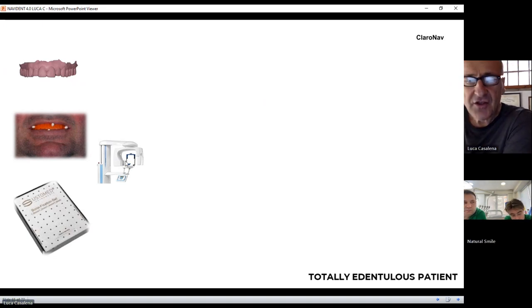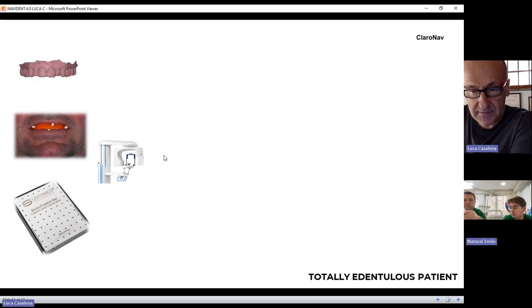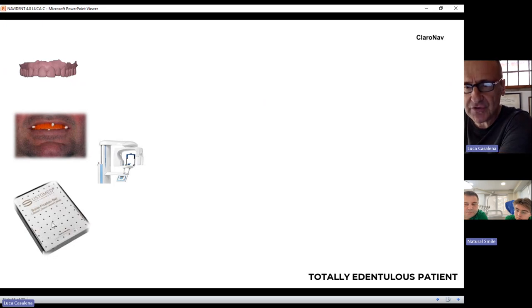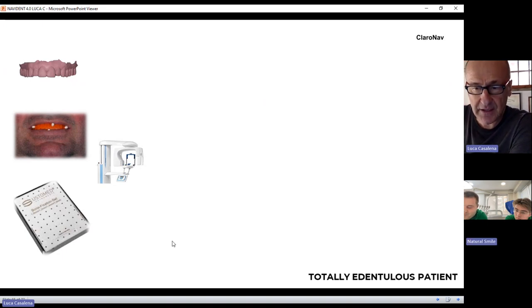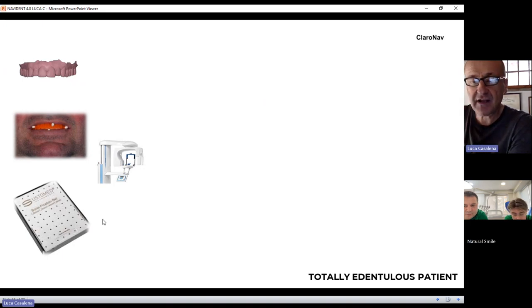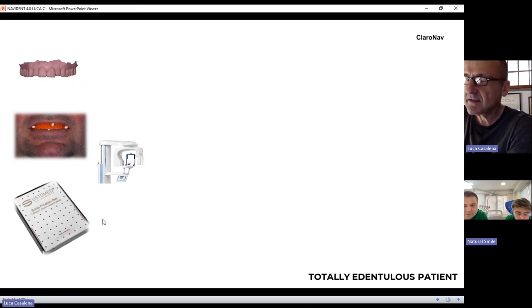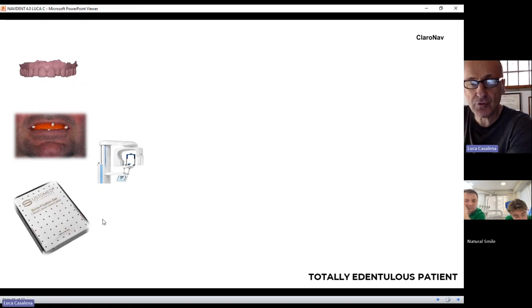Once scanned, you can send the patient home because you have the opportunity to leave the mini screws on the jaw. They can stay easily for five days without risk of osseointegration. The important thing is that those screws must not be pushed by the pontic or whatever the patient has in their mouth. If there is any risk of a pressure sore on the screw, you need to relieve the pontic to avoid any contact between the mini screw and the pontic.